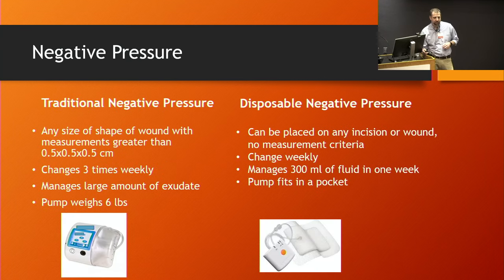And then we use a lot of wound vacs, so any wound, any full thickness wound, we can use the wound vac. The advantage of the negative pressure, quicker healing. Easier dressing change. If you actually did a traditional wet to dry saline damp dressing and changed it 3 times a day, those studies actually show that it was equivalent to the wound vac, but you had to do it 3 times a day.